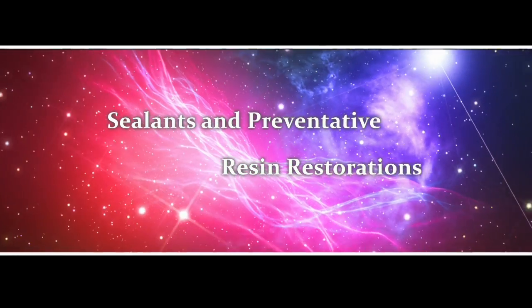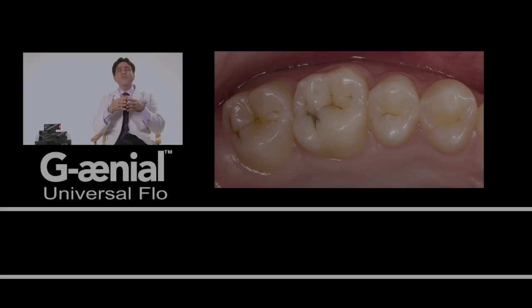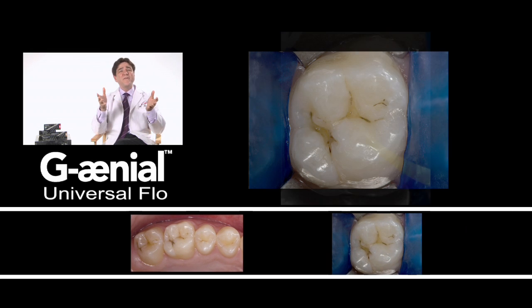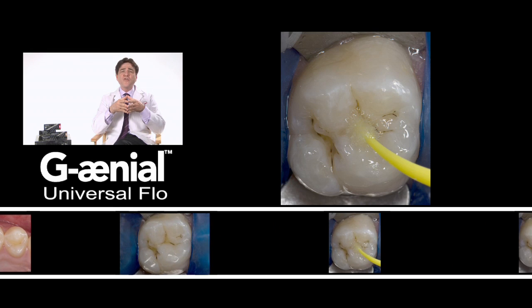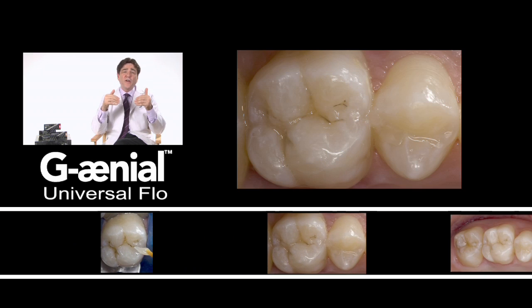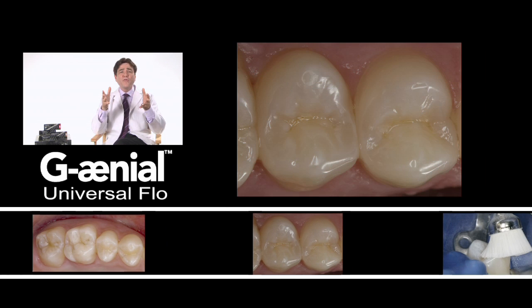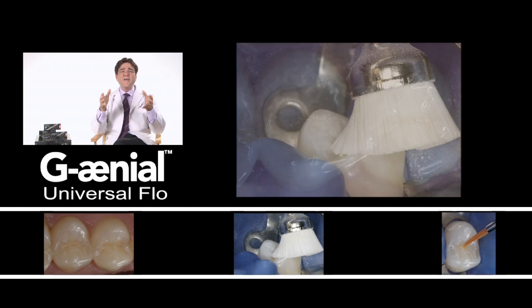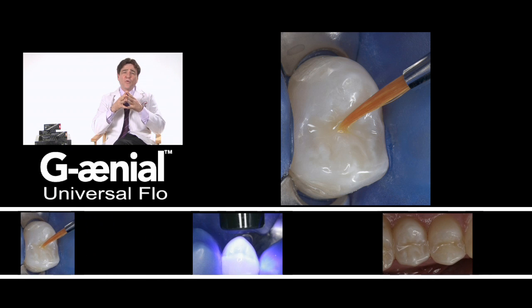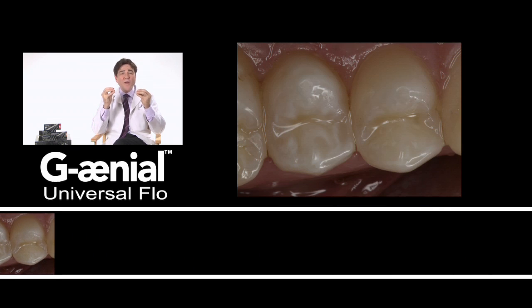As sealants and preventative resin restorations, next-generation flowables can be utilized as composite surface sealants, pit and fissure sealants, and preventative resin restorations. These highly filled nanomaterial formulations can be cured in a thin film and have the potential to increase the wear resistance of posterior composite resin restorations. Since the interparticle spacing is reduced and the filler particle density is increased, they can provide more reinforcement and protection of the resin matrix.